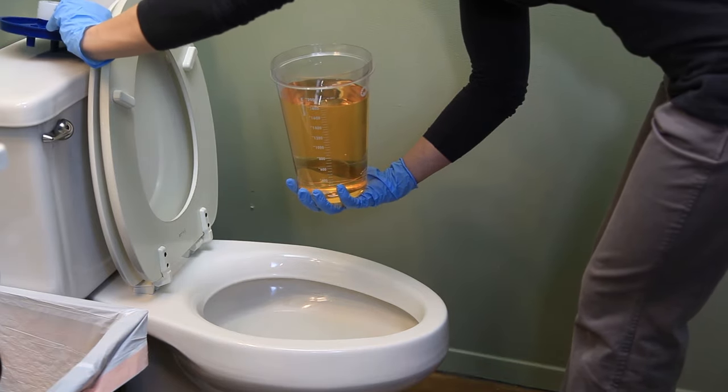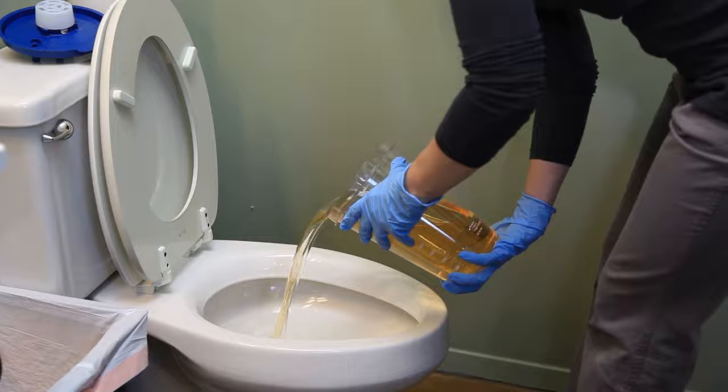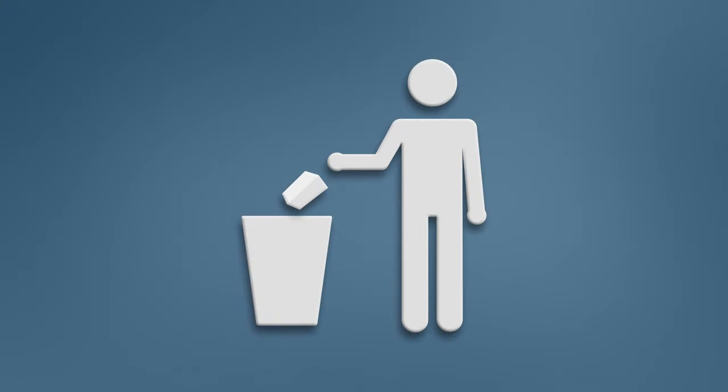Carefully remove the lid and dispose of urine into the toilet. If using a privacy cover and it gets wet, remove and discard.